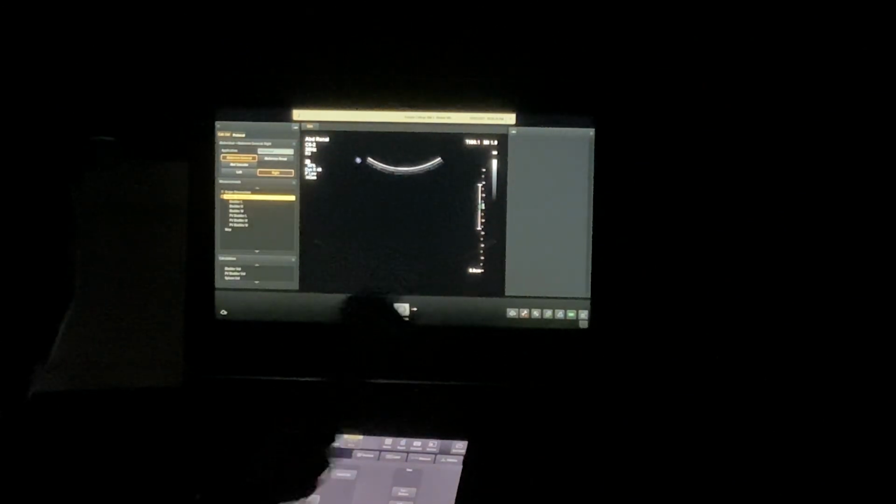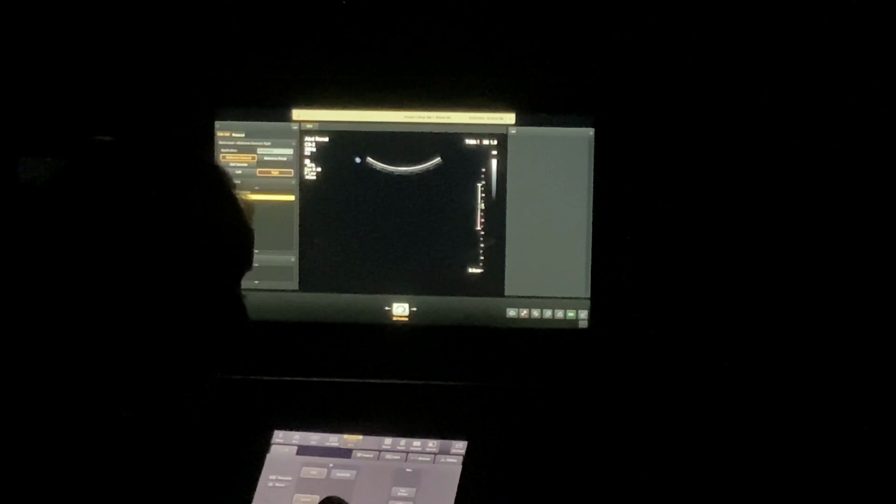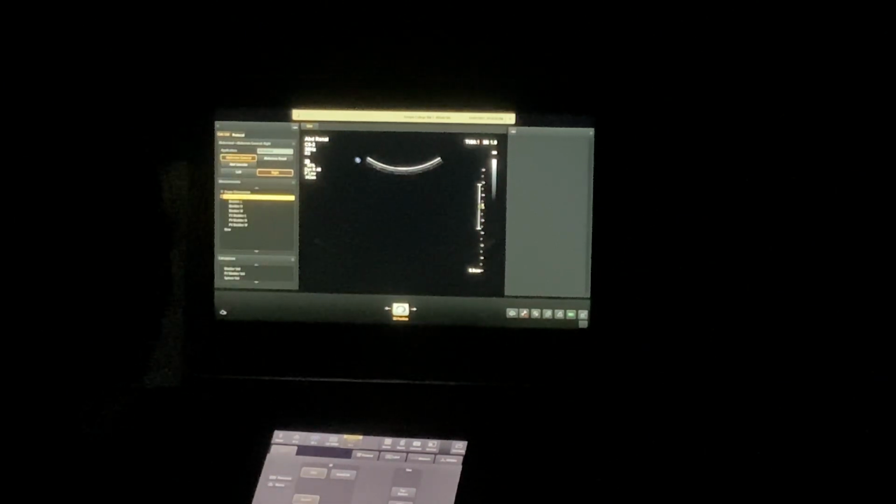Any questions? Is that when you're in trans only? For the volume, long and trans, because we need a length, a height, and a width to calculate volume. So you'll do the length one, put it in the package, height and width in the package, and it'll calculate the volume for you. And you take height and width in trans. Okay? Any questions? Everybody feel good about it?